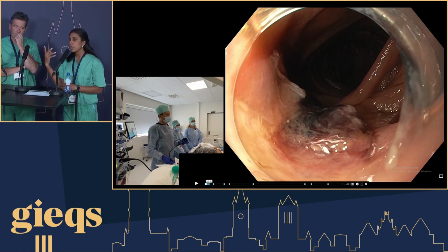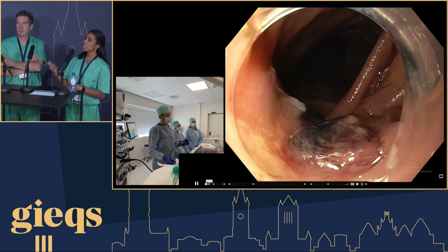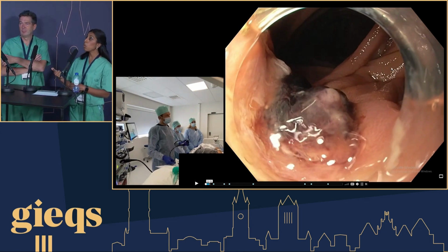So some of the things that were running through my mind as you're playing this would be having a plan before you do this endoscopy. So obviously knowing the surgical anatomy, knowing what had happened on the previous endoscopies, and actually really discussing it with the index surgeon, I think is always key. I always find if I have an issue after a colonoscopy, I would want to know about it. And in the same way, it's really crucial to have that conversation before you do any procedure, because you might want to plan it with an MDT sort of setup.